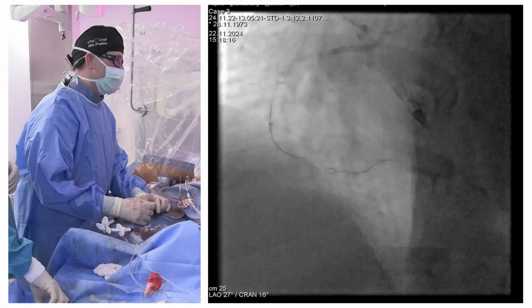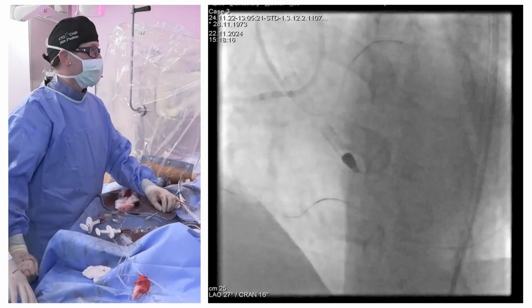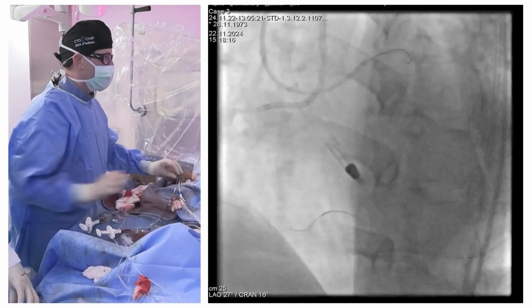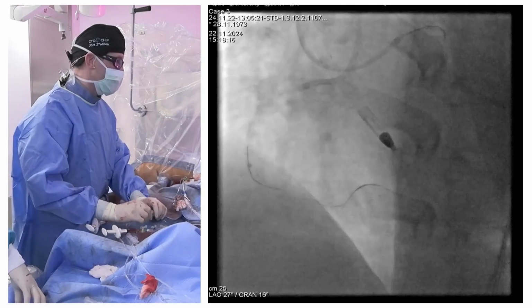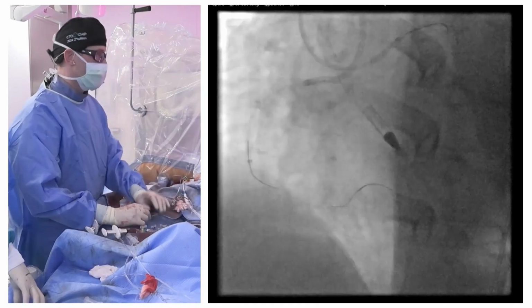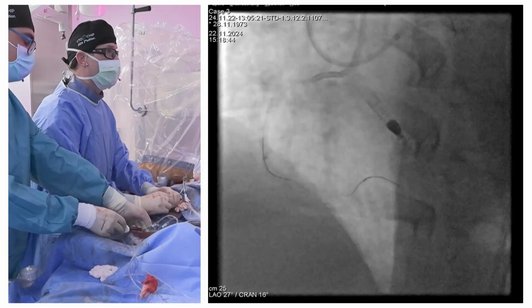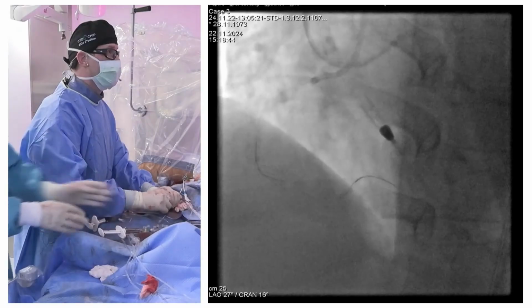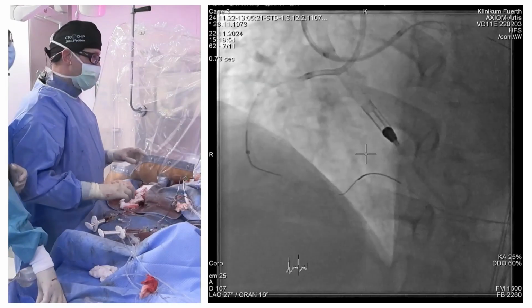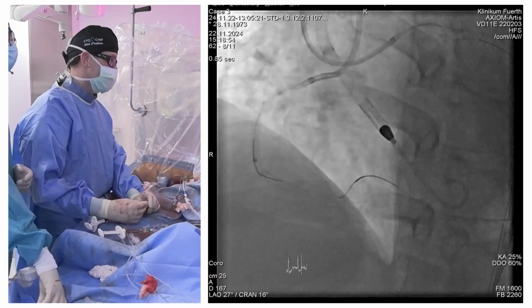But you can appreciate a nice knuckle. But I'm not sure if I can see it. Did the retrograde microcatheter pass the kink in the stent? Oh, it's actually in the stent. It's basically within the bifurcation. I can give you a quick cine. Sorry, I have to check my retrograde. Okay. So we are basically in the stent, but having trouble to get around the corner there and then further into the distal RCA.